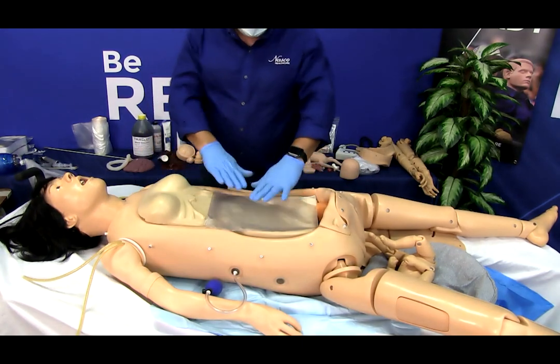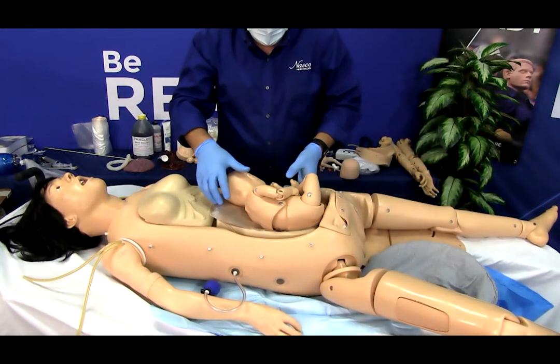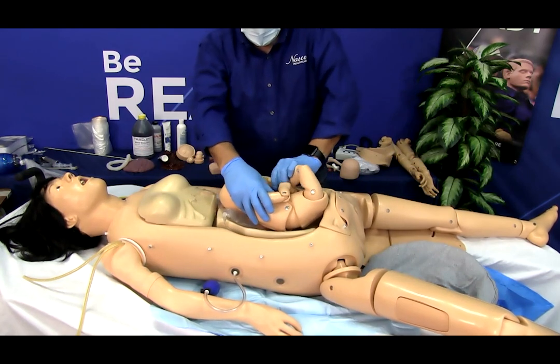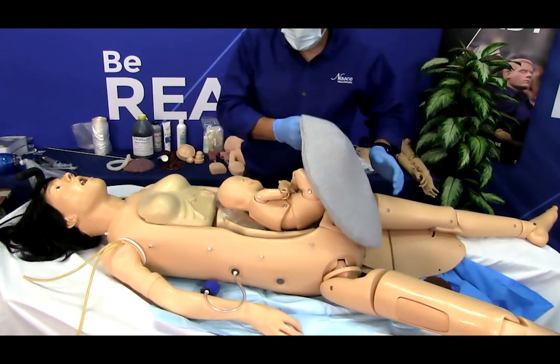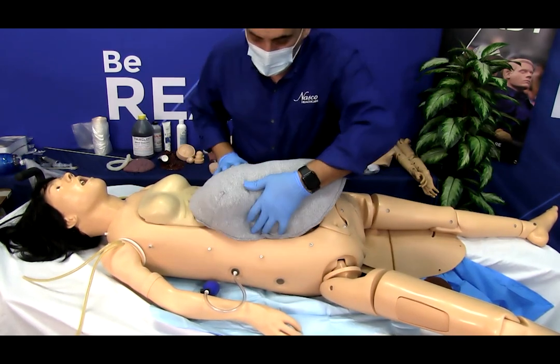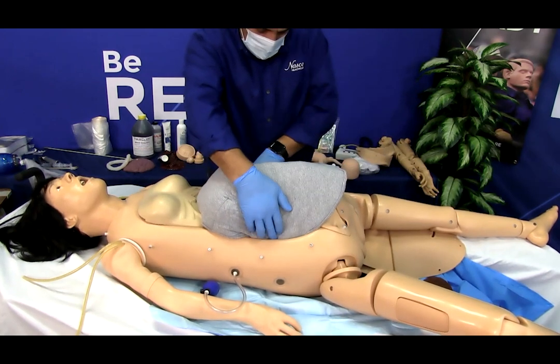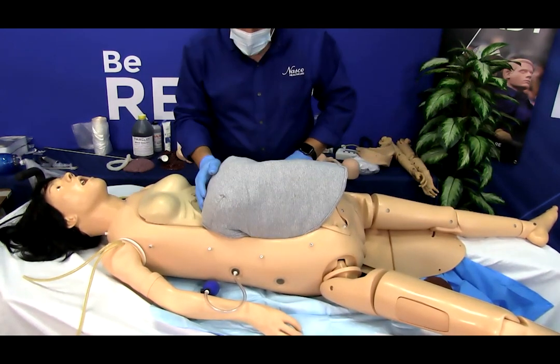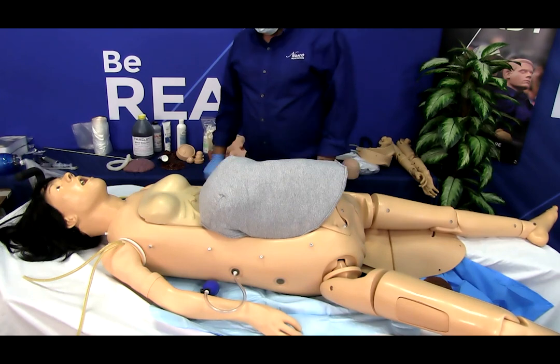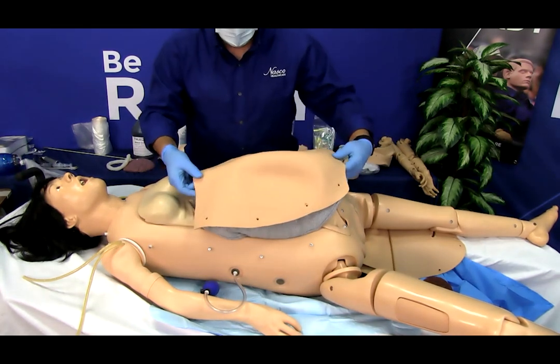Position the articulating fetus as desired. Lay the abdominal pad over the fetus with the narrow end passing beneath the pubic bone and the edges tucked in around the sides. Attach the normal abdominal skin to the torso.